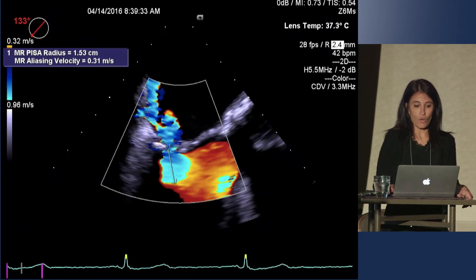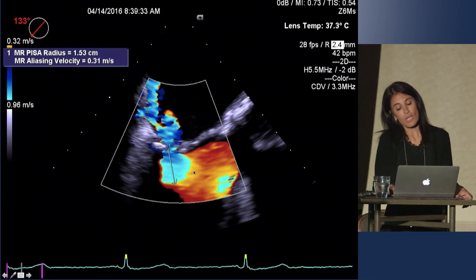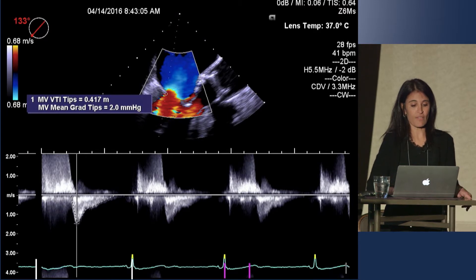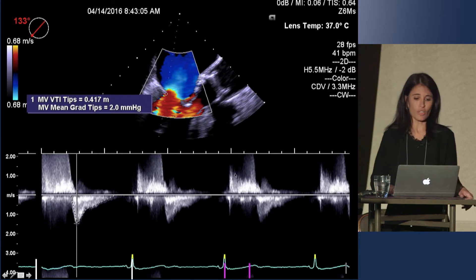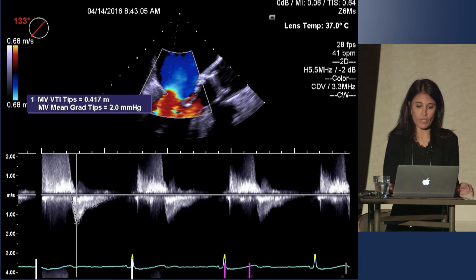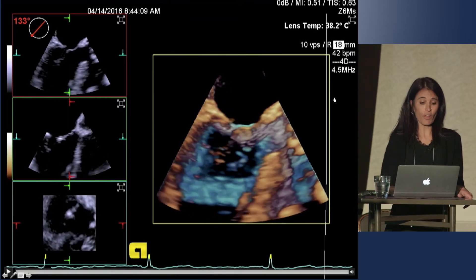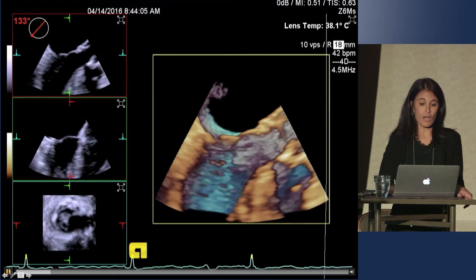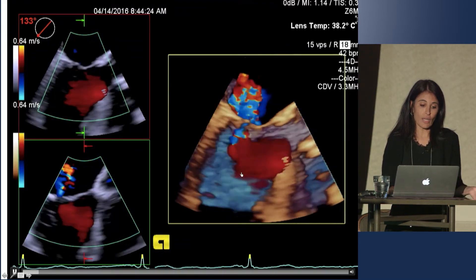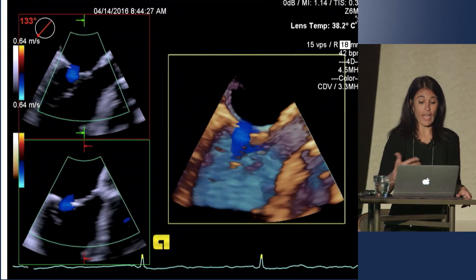This patient had a significant PISA and somewhat eccentric, so I imagine that a lot of this is underestimated. We always do a valve gradient before we clip the patient. This patient had a valve gradient of about two, but the concerning thing is that the pulse rate was only about 40, which we didn't think was really physiologic for the patient when she started walking around. We also do a 3D volume acquisition of the LV, particularly looking at the inflow-outflow, and with this we want to have enough color flow so you can see the LVOT outflow.